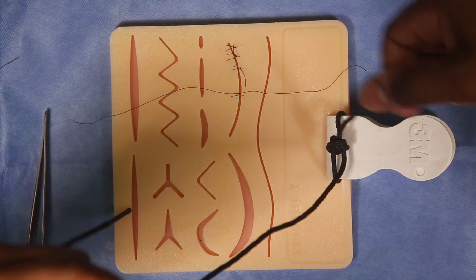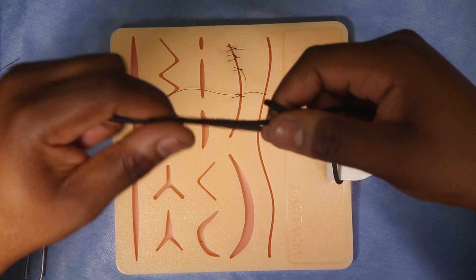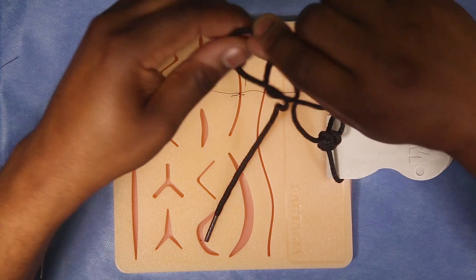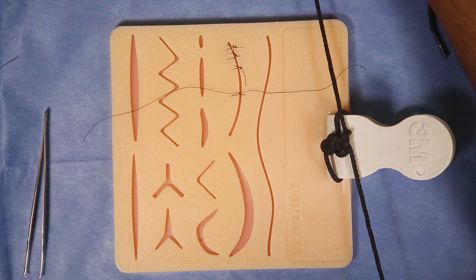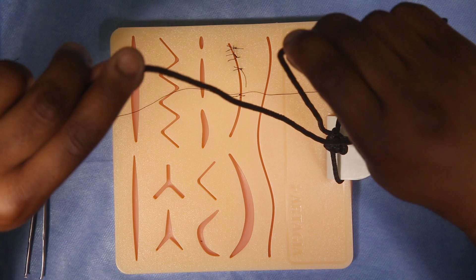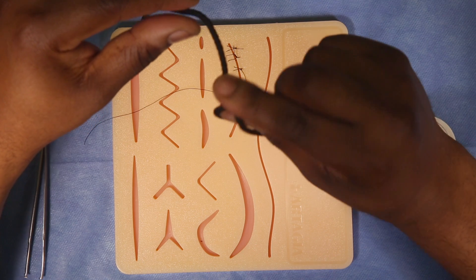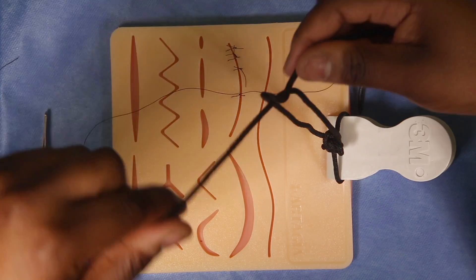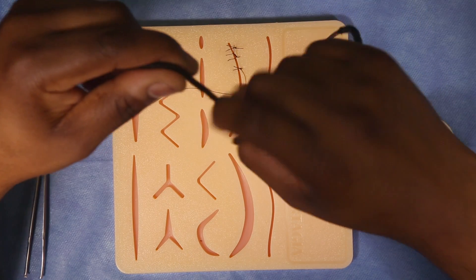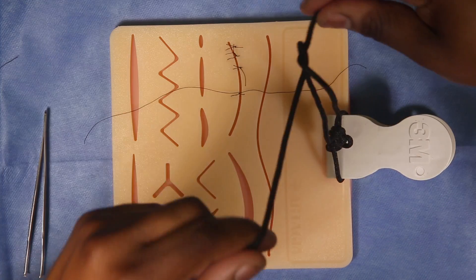To lock this surgical knot, do just the opposite. Previously you threw with your index finger through the loop; this time use your thumb instead, then pull it through and lay the knot down. So index finger to throw it under the knot the first time, then thumb to throw it through the knot the second time — switch your hands each time.